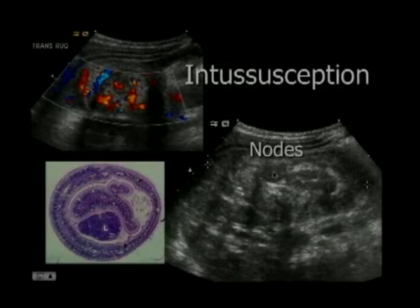You may see lymph nodes, okay, not the same case, but here are little lymph nodes, a path specimen showing the intussuscipiens, the intussusceptum with associated fat, and in this case a mesenteric node probably acting as the lead point in that case.